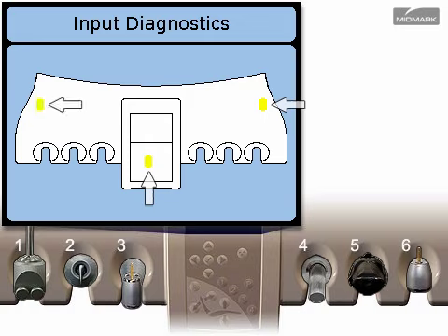The three E-field sensors on the bottom of the unit can be checked from this screen. Press to test.